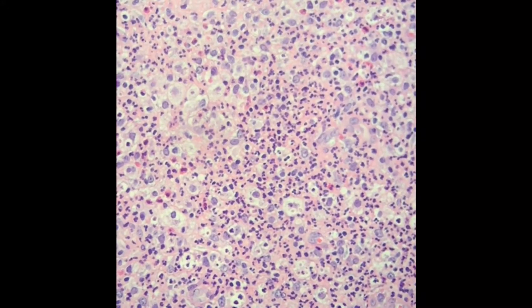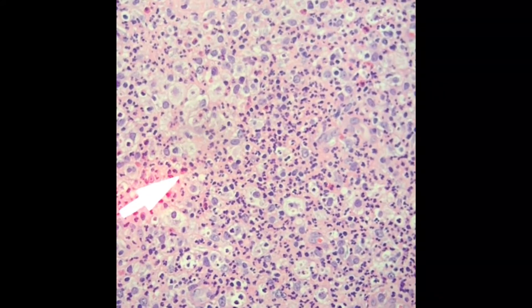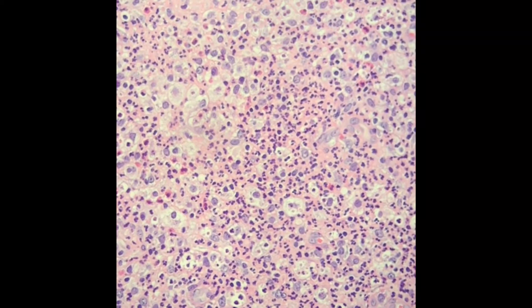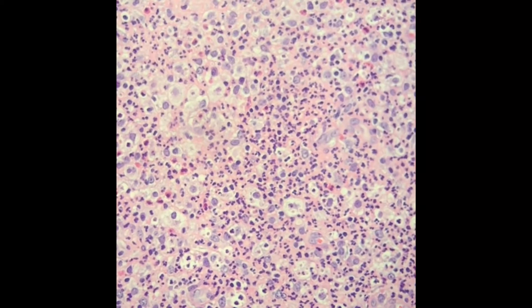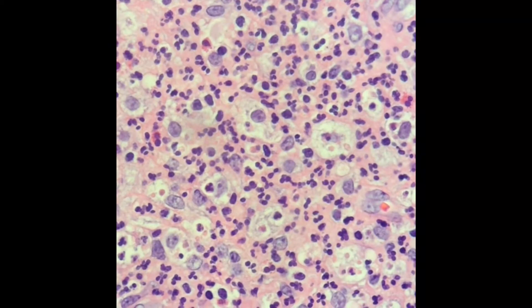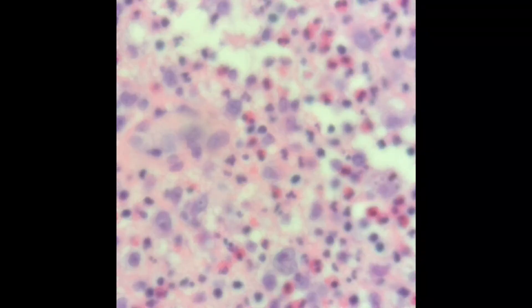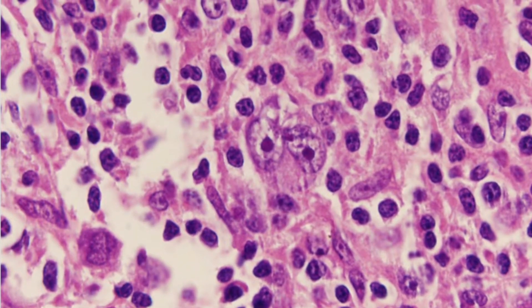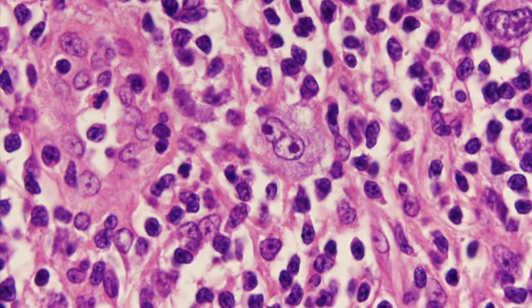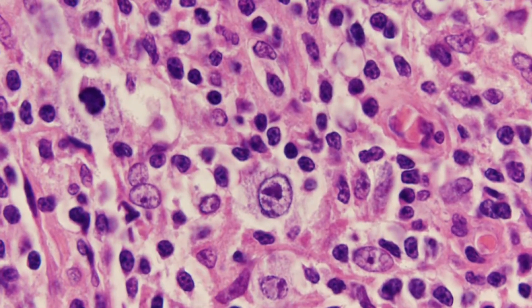Going to a little bit higher power, you start to appreciate the cellular constituents of this infiltrate. There are lots of eosinophils all over the place, interspersed with lots of neutrophils as well, and also a lot of histiocytes. But if you look carefully at a little bit higher power and scan through this mixed infiltrate, the other thing you see are some large atypical cells. This is a really good example of what those large cells look like — a really irregularly shaped nucleus with a rather large reddish-purplish nucleolus.